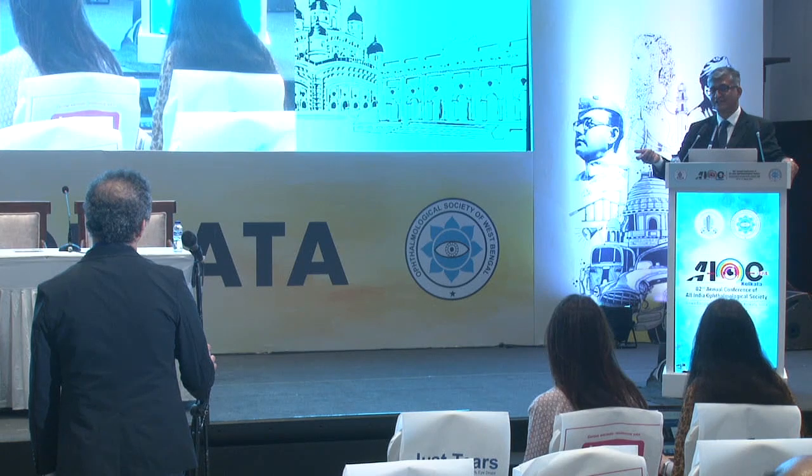So another challenge that comes in ectatic disorder is if you have to do a full thickness graft or other procedure, then you really get a refractive surprise of great magnitude. Yeah. Contact lens, yeah. Contact lens. Right.